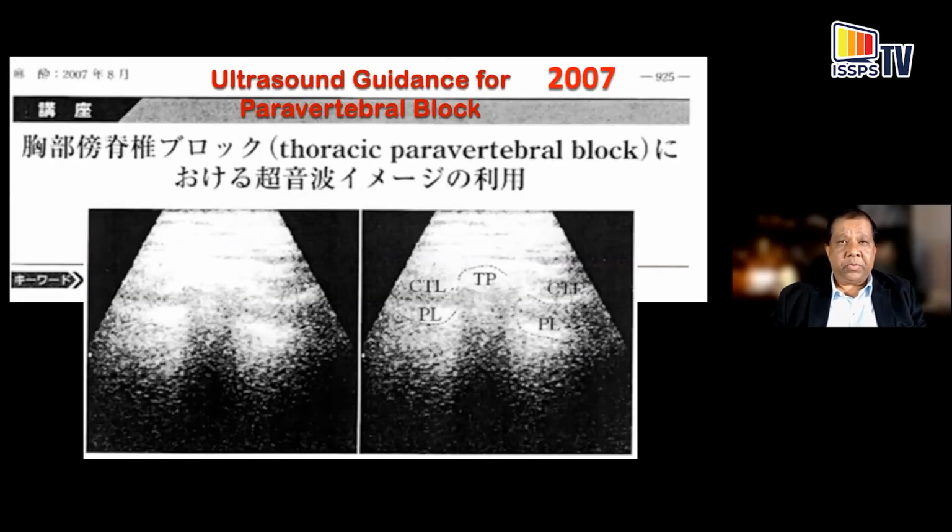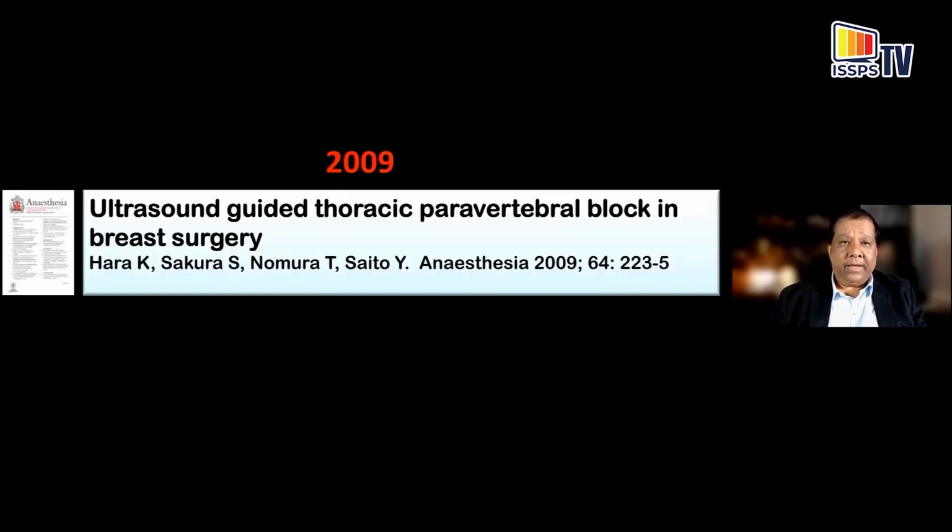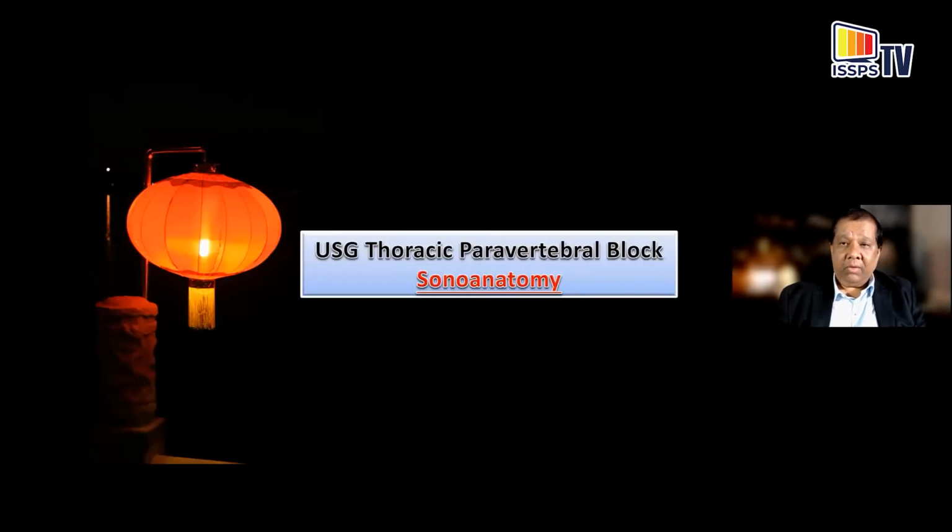Actually, the first description of paravertebral block using 2D ultrasound for real-time intervention was by a group in the Japanese literature, Dr. Hara and Dr. Shinichi Sakura from Shimane. I will come to what they did later.